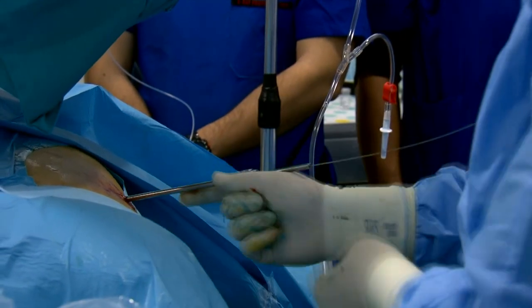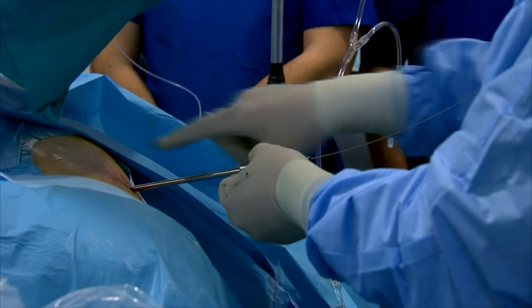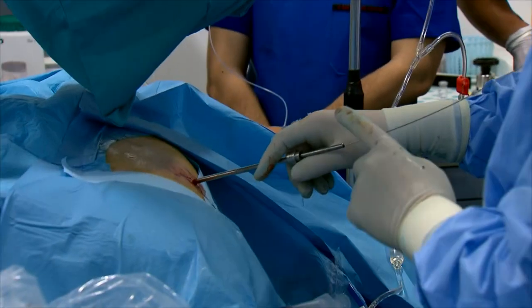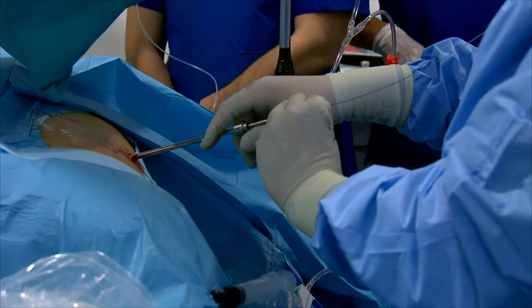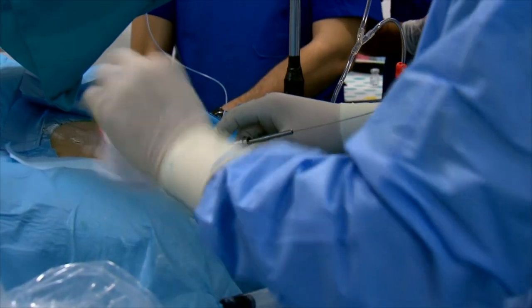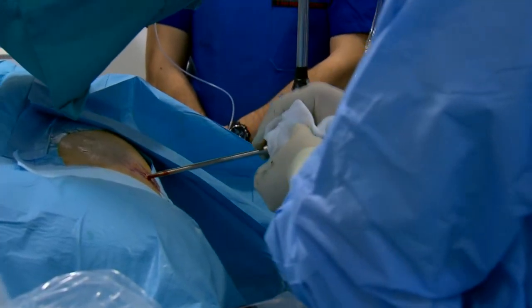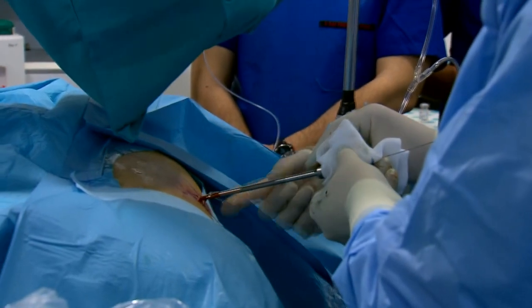And now I'm moving like this. In order to avoid a sudden movement, I have my finger here for security reasons. My left hand is taking the guide wire and the dilator together. I take something like that, put it together. Gel in front. Once more, always with gel.